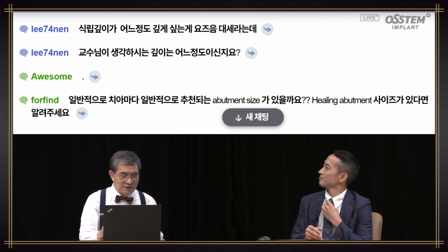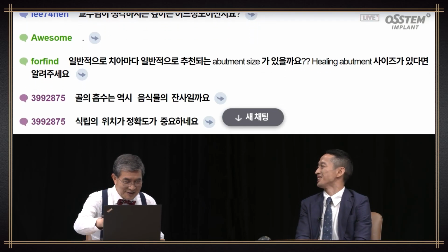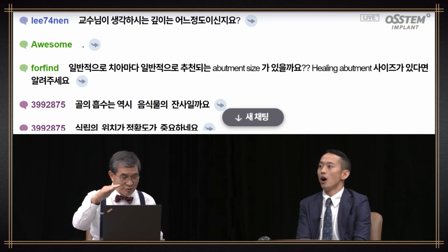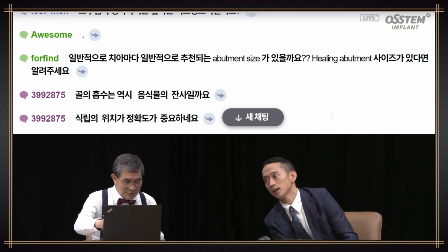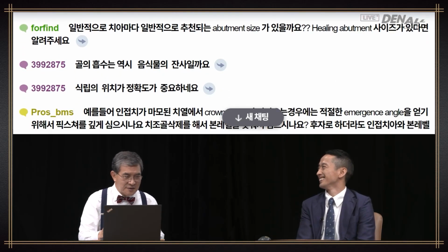How deep should implant be placed? So you talked about how placing implant deep. Yes, 1 to 1.5 millimeter. Up to 2 millimeter, yes, I believe that's okay too. I think that'll be sufficient. There are people who place it deeper.